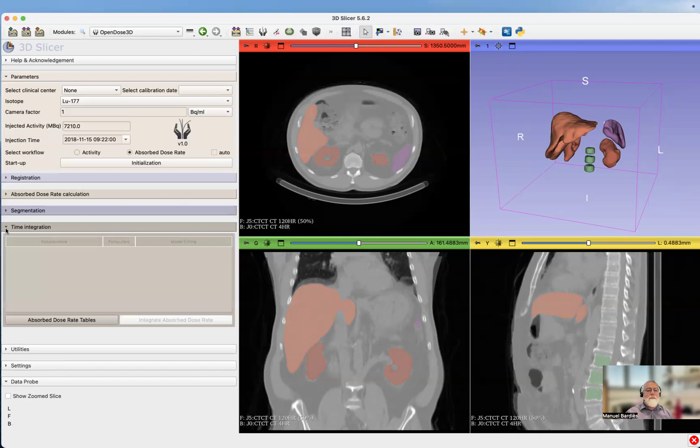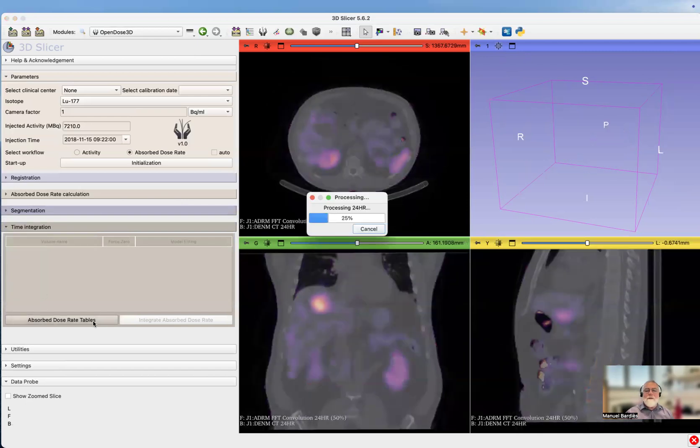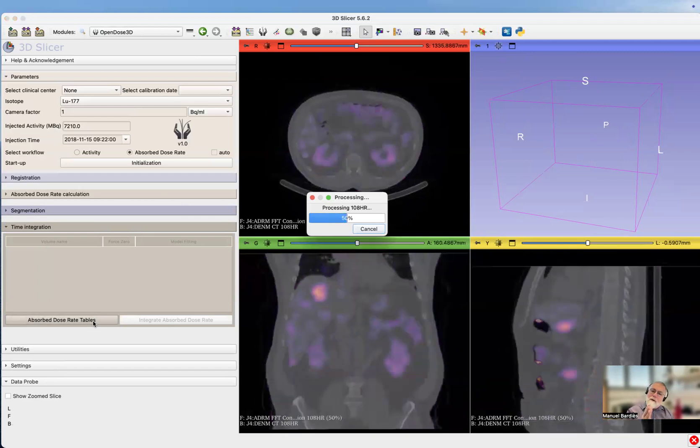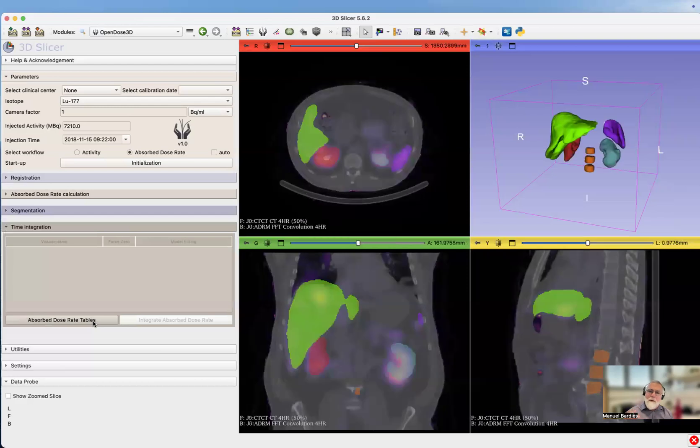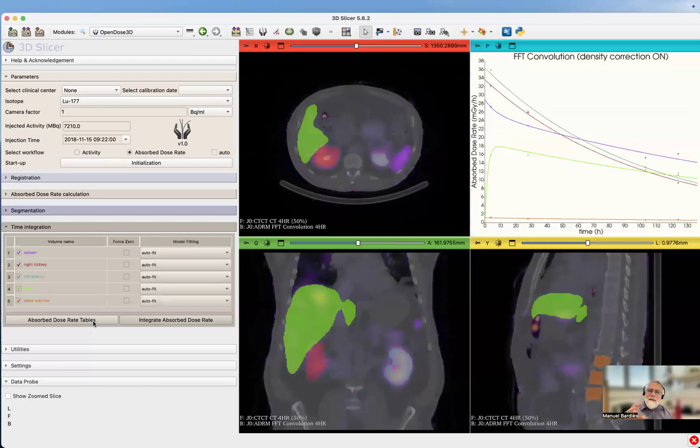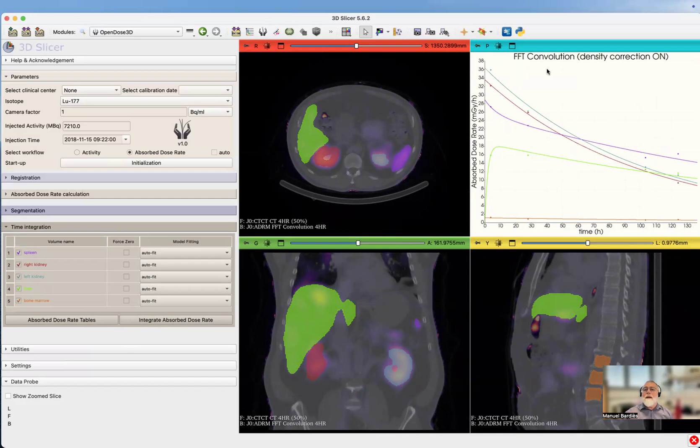We can now have time integration. We generate the absorbed dose rate table. Remember, we have the absorbed dose rate computed at every time point for the whole field of view. What it does here is just selecting the volume of interest at every time point and extracting the average absorbed dose rate in each volume of interest. Here you have what that plotted. It reminds you it's FFT convolution with density correction on.